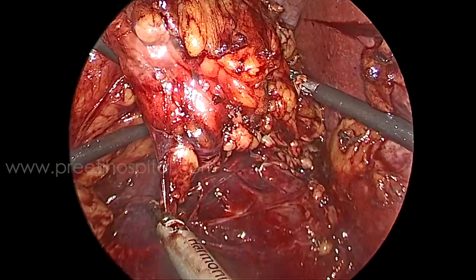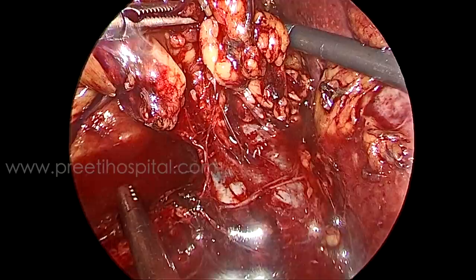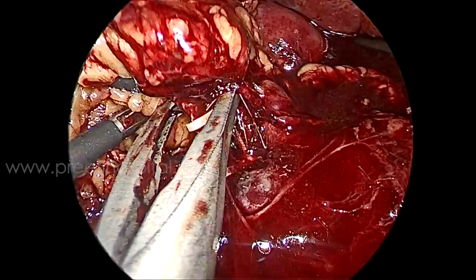This happened because outside there were two retractors for the liver that gave resistance. Usually this doesn't happen with suction because it is blunt — it can happen with Maryland or harmonic because their tips are very sharp. Always wash the area; washing helps for better coagulation of the approximated edges and improves light absorption. Now see — everything is under control, and the second vein is visible.